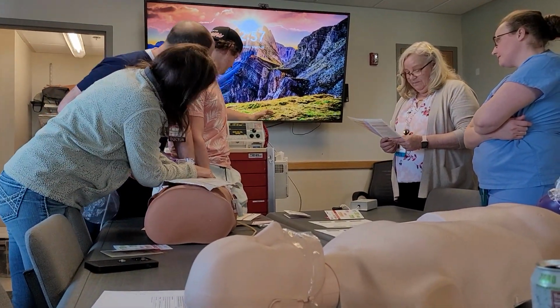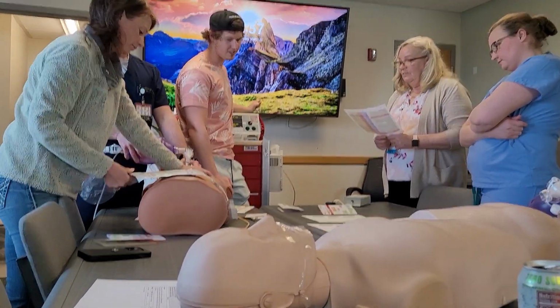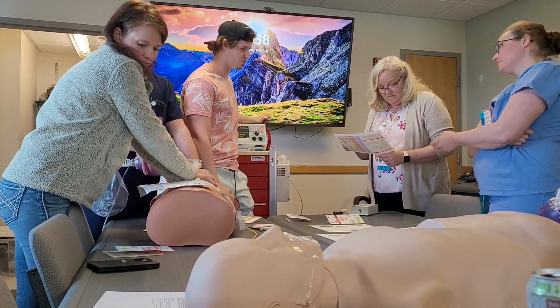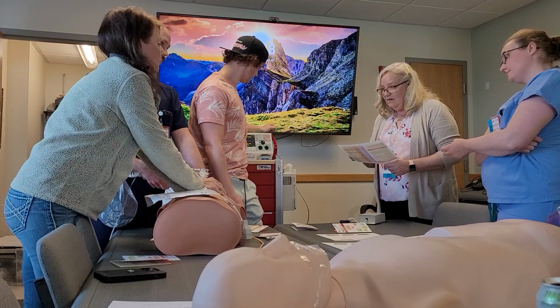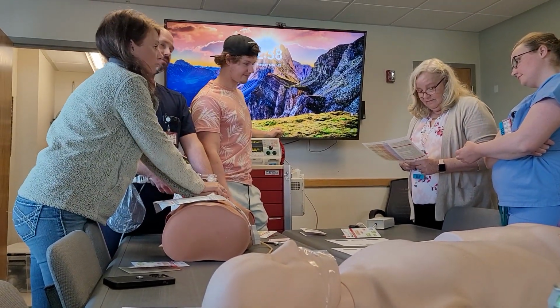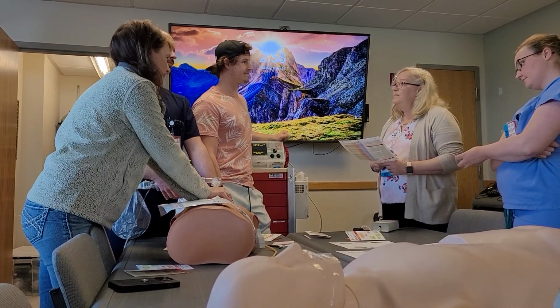Okay, so there's nothing, no rhythm at all. So we can continue the high quality CPR, get another milligram of epi started. Okay, so the next check will initiate it after 2 minutes of CPR. You want more epi? Yes.